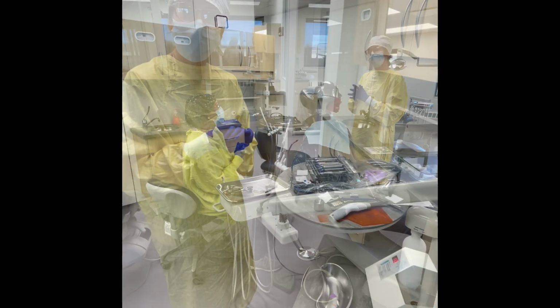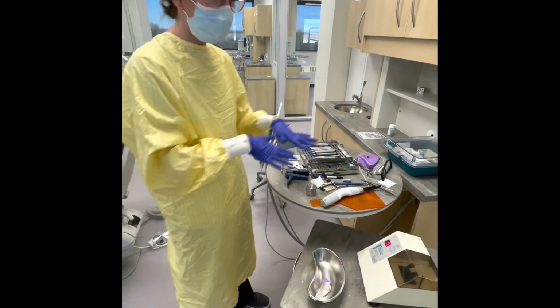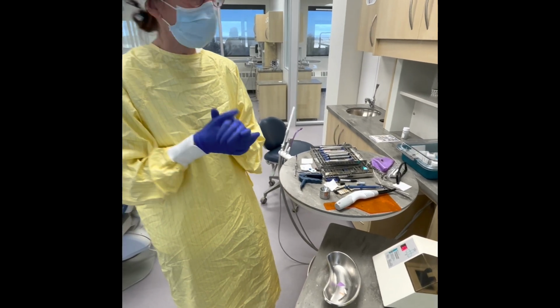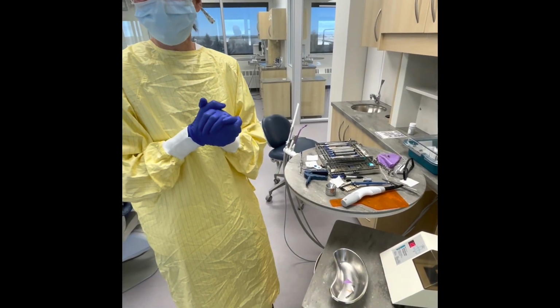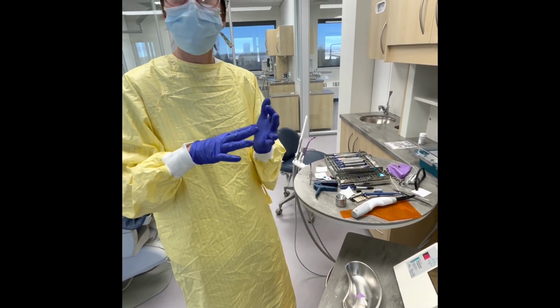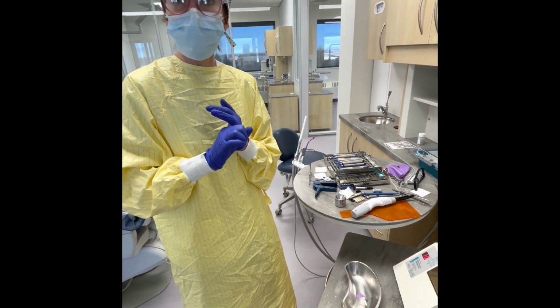Thank you. All right, so Martha is gone. As you can see, I've made a complete mess of my rotating card surface. That happens a lot, but now it's time to tidy up. One of the things that you're gonna have to do is make sure that you get your sharps and your biohazards to the correct area when you're done, okay?